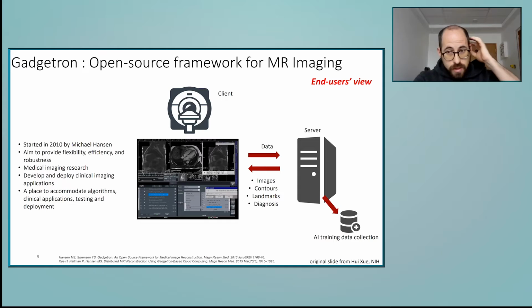So this is a typical reconstruction. You have the scanner, the host where you launch the sequence, and a server behind called the MARS, which does the reconstruction.